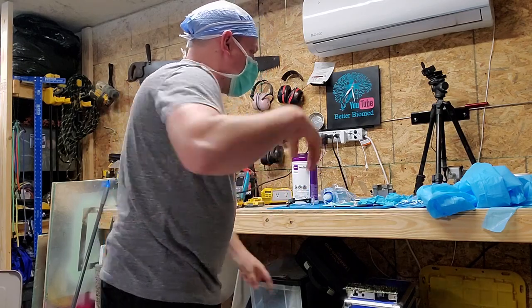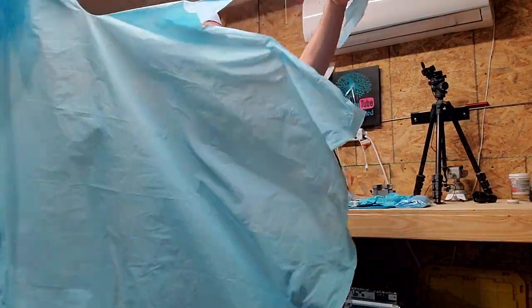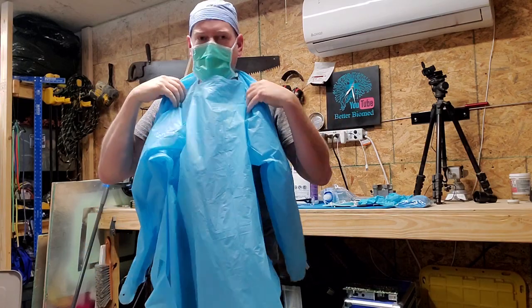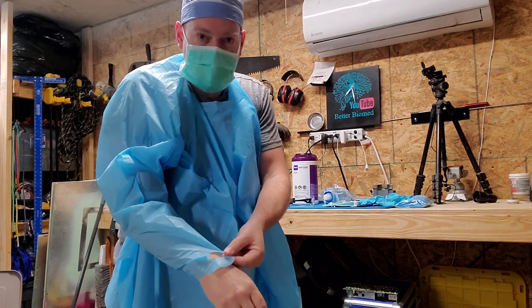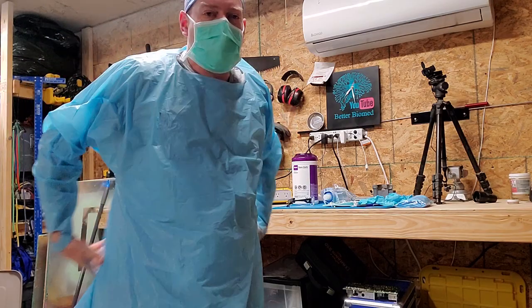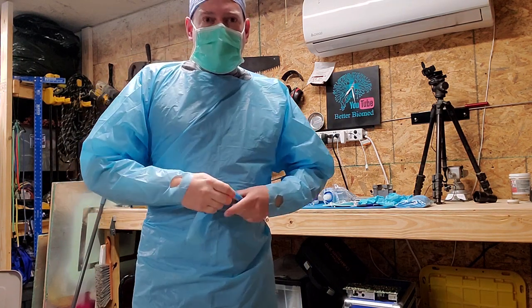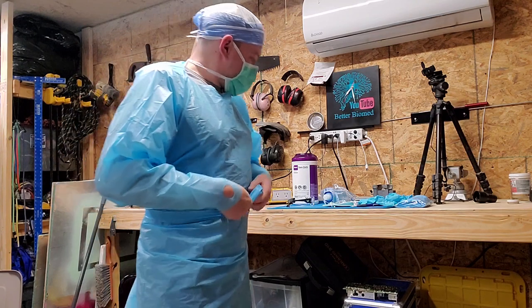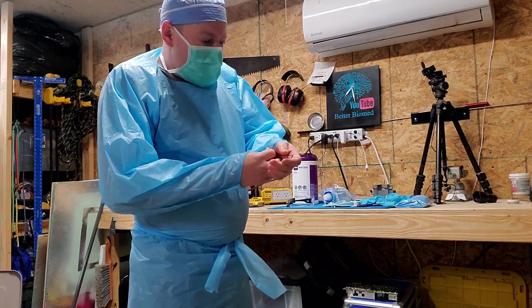Now we're ready to start the next step, the gown. Now this is a disposable gown. Most of them are nowadays. And on this one here, it ties behind you. So with this type of gown, put the head in first. There's two sleevelets. And notice there's a thumb hole. We'll get to that in a moment. I'll put my gown on all the way. You got two tails. I'll put them around me in the front, and I'll tie it up just like so. All right, now that I got that on, I'm going to go ahead and put my thumbs in the thumb holes.